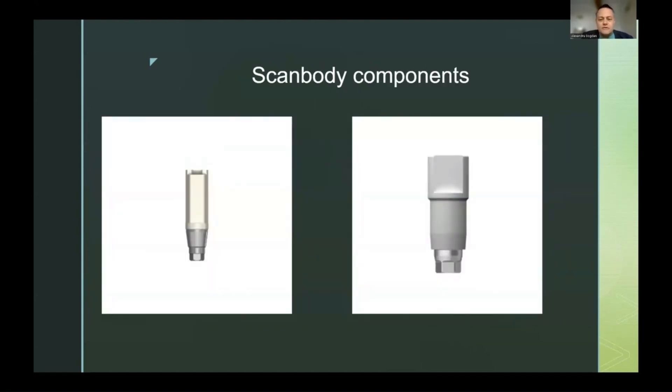Scanbodies have two or three components. Every one of them has a connection that needs to be correctly seated inside the implant. You have to check that the connection doesn't move — if you have a hex, trilobal, or any other connection, verify the scanbody is not rotating. Torque the scanbody to the correct measurements, and afterwards perform an X-ray to verify the placement is correct before taking the digital impression.